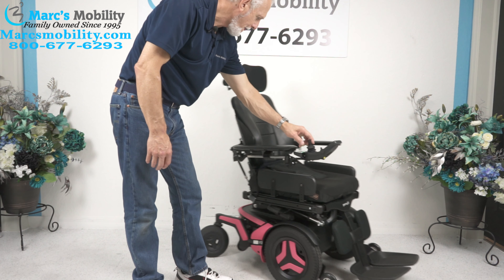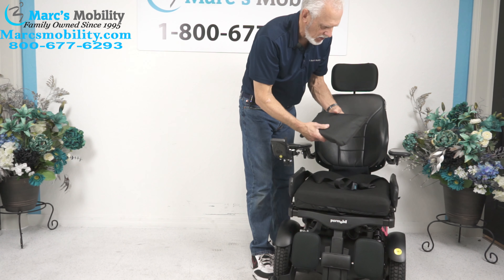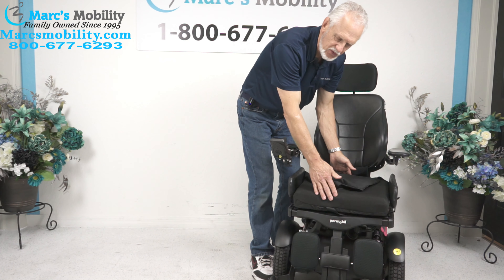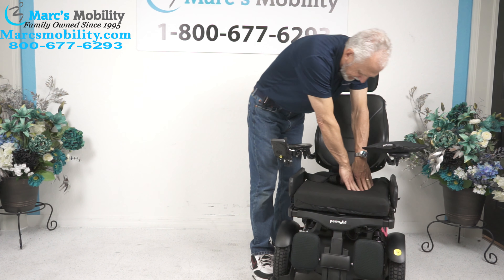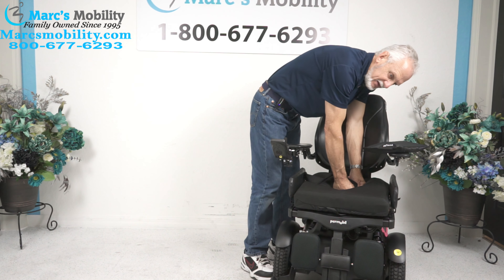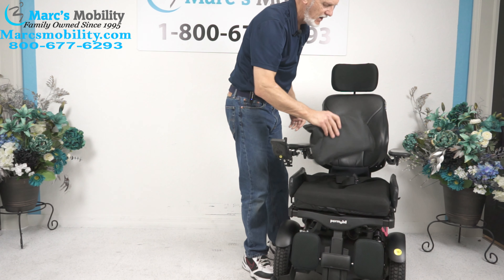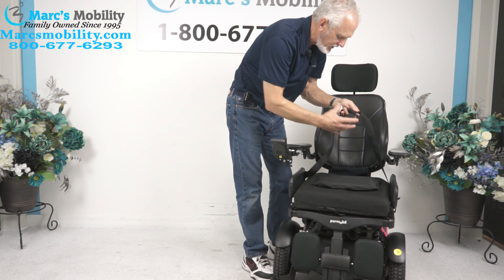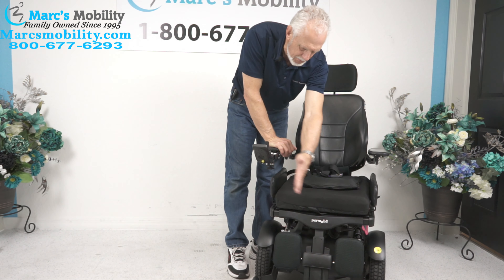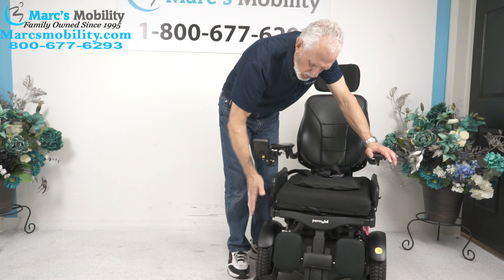Let's look at the front of the chair. You've got your owner's manual here with all your tools. This is a 17 by 19-inch cushion — it's a really nice cushion. The front half is foam, and the back half right here is full of gel — probably one gallon of gel — it'll contour to your body really nicely. You do have a safety belt. This chair also has side pads, which keeps your knees from buckling out. You won't be hitting any doorways on the way through a door — it keeps your legs together.